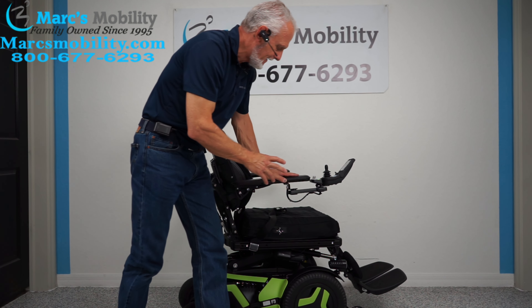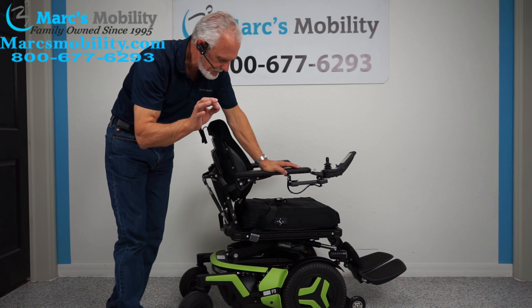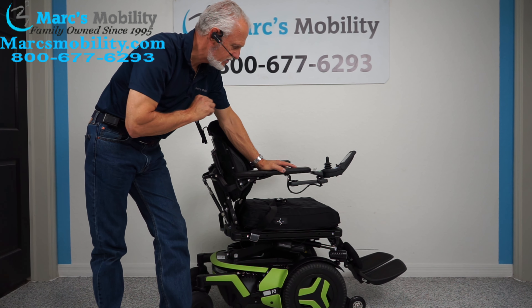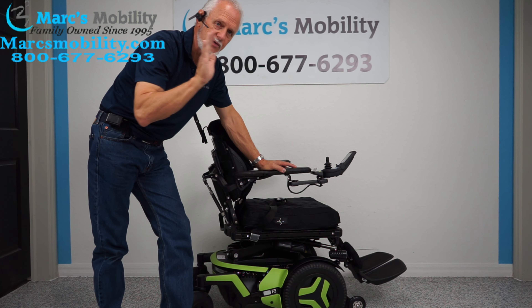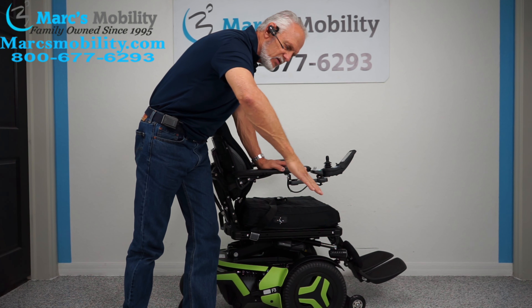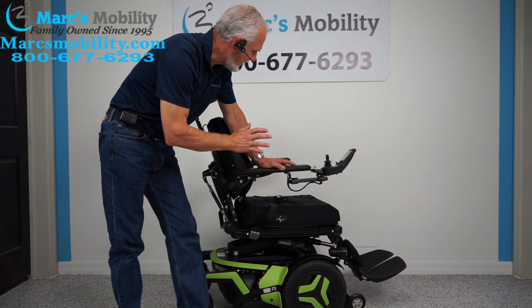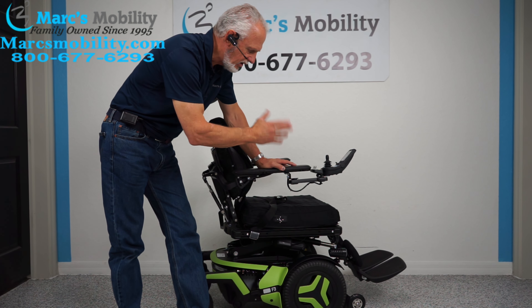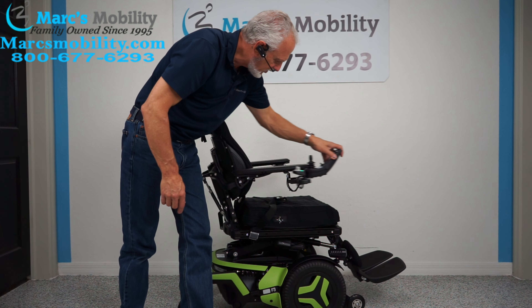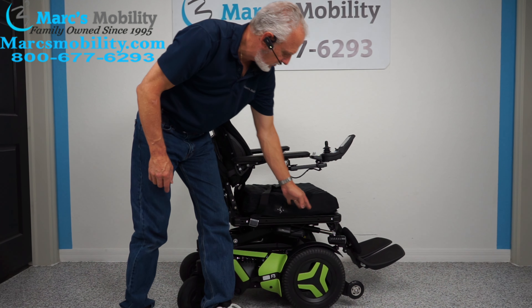Let's recap. This is a Permobil F3 front wheel drive power chair. This chair has seven miles — practically new. It has five electrical functions: 12-inch seat lift, electric tilt, electric recline, electric feet, and the interior tilt. This chair will not be here very long — it's got the color, the whole lighting package, the USB port, the swing-away joystick, a safety belt, and an air cushion which is very expensive. It's a beautiful power chair, ready to go.